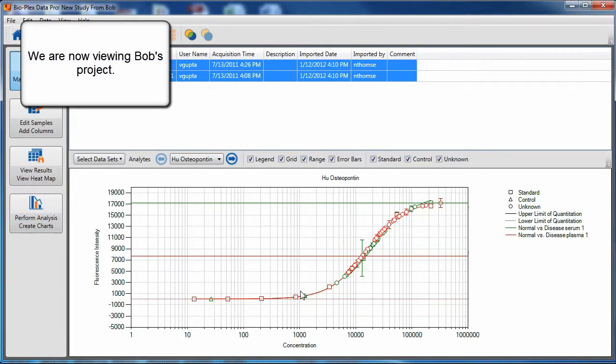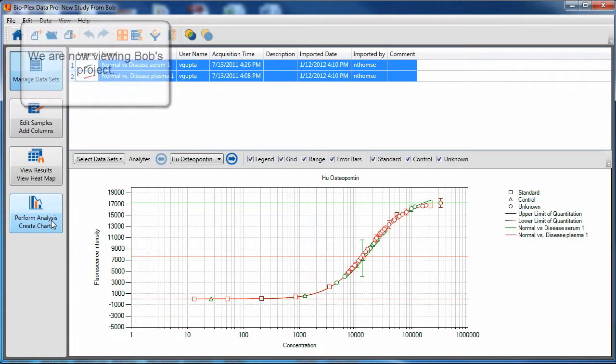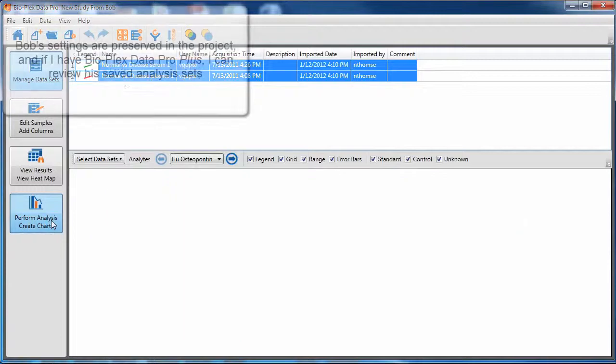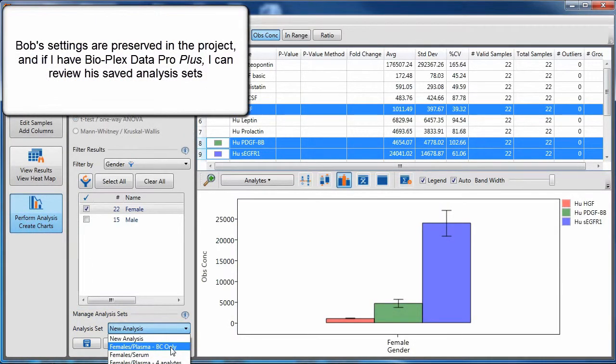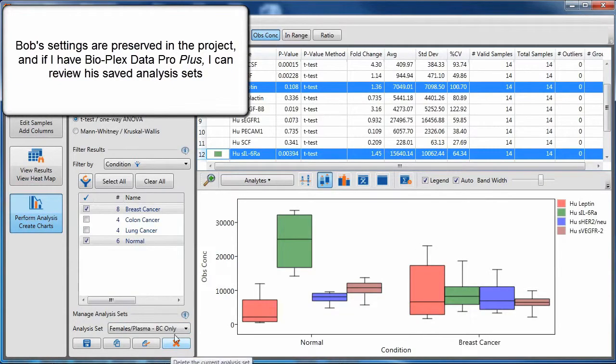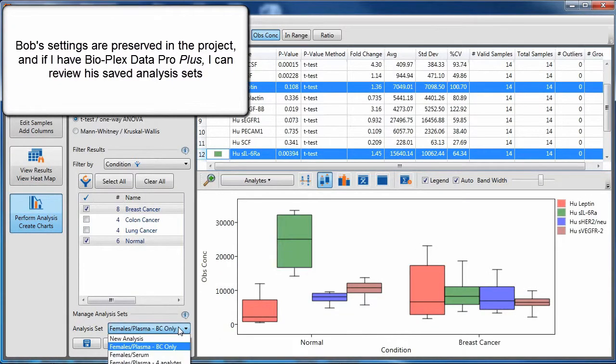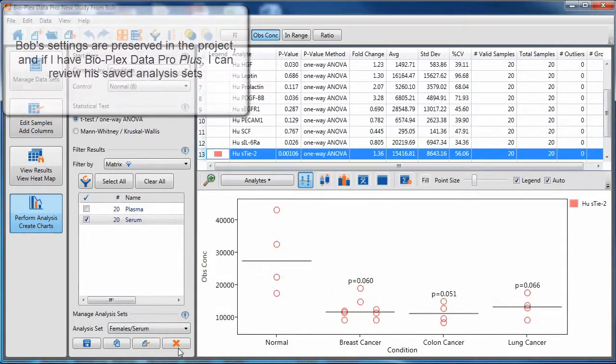Once I import the project, I am now viewing Bob's project. Bob's settings are preserved, and if you have BioPlex Data Pro Plus, you can review his saved analysis sets.